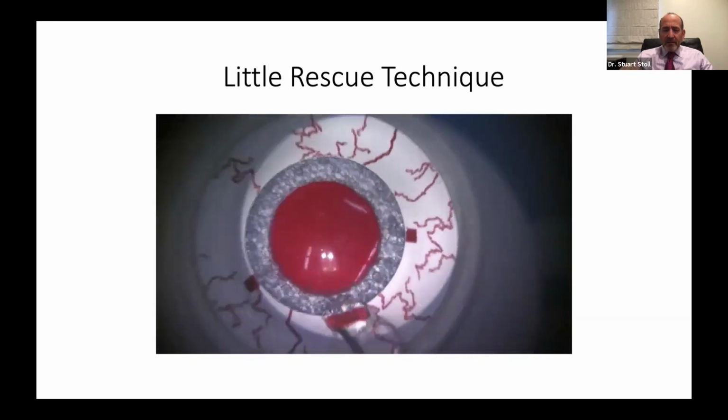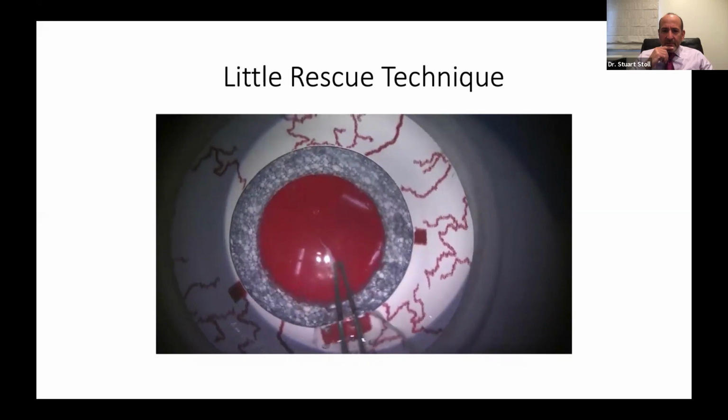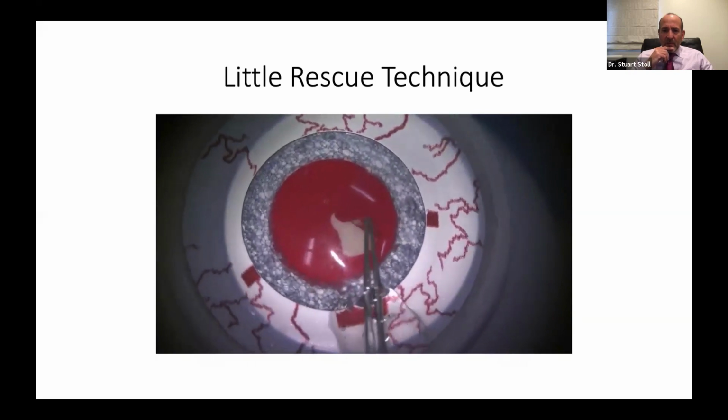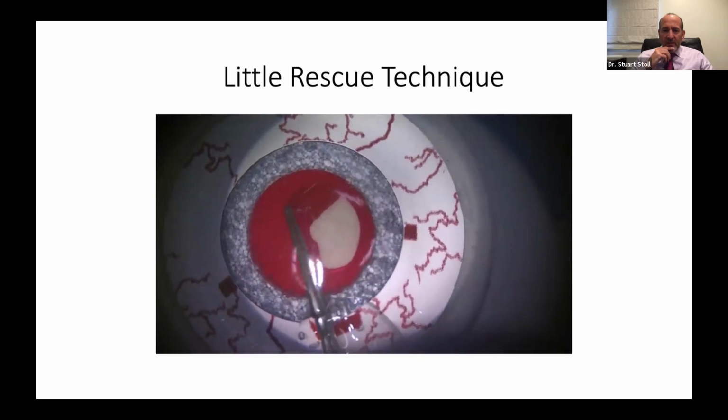Here's one last demonstration of the little rescue technique. And we're bringing it around.